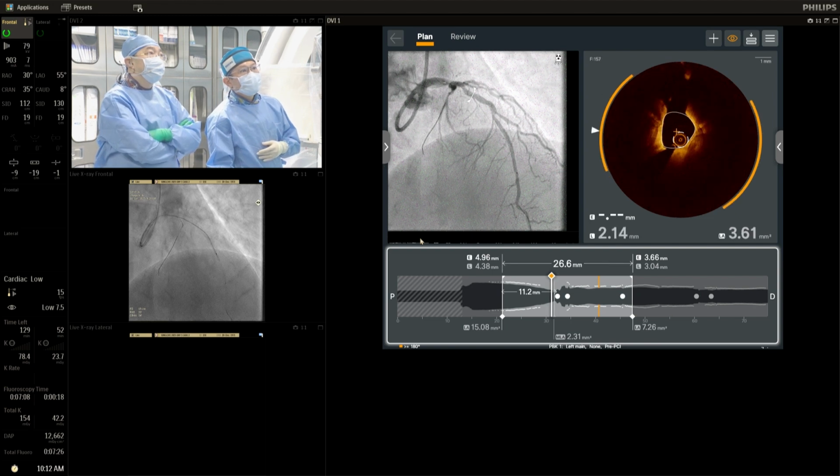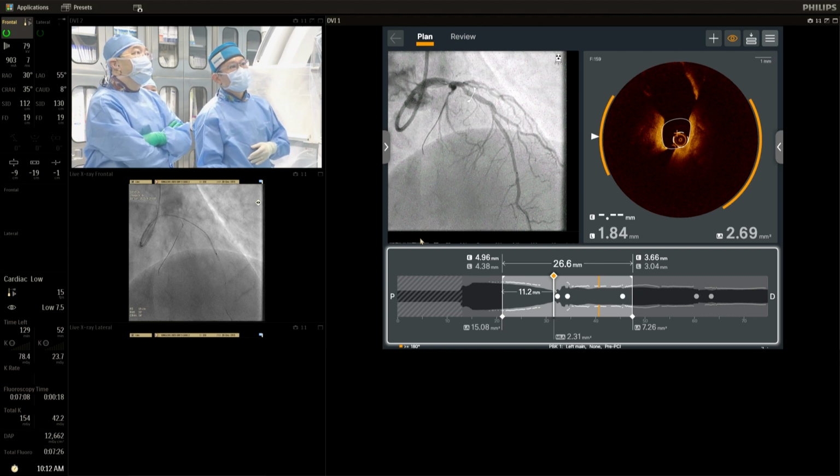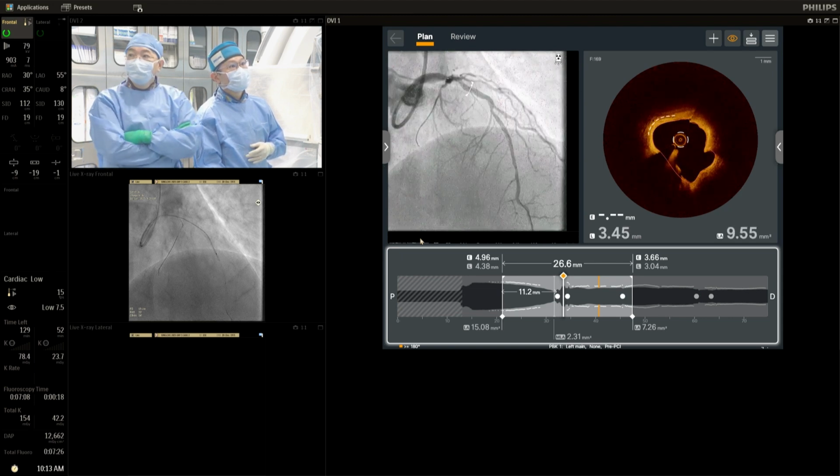All right, here is just at the distal left main. So now we start to see a little bit more calcium. In the 3 to 4 o'clock, we can see a big chunk of calcium there, and the 9 o'clock position as well. I suspect it's all around, just that we can't quite see it. There is, as I said, a bit of fibrous tissue between the lumen and the calcium, and that has implications, because if we are going for an atherectomy strategy, then it might not be so effective to ablate if there's a layer of fibrous tissue between the lumen and the calcium.